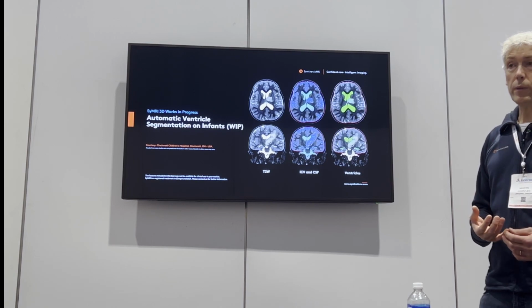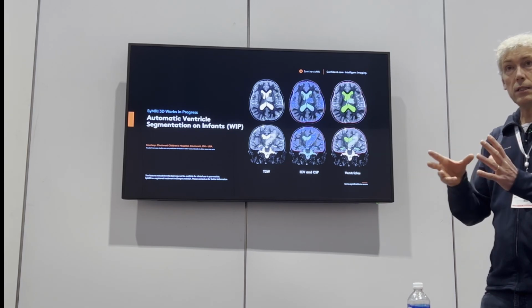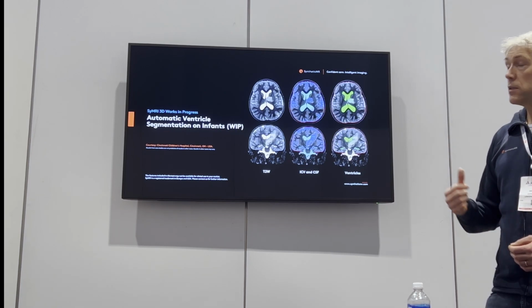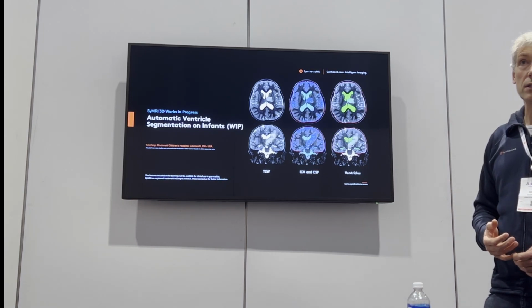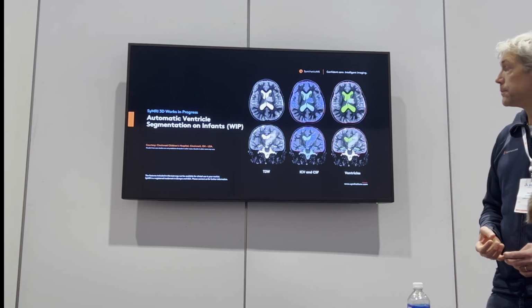There are quite a lot of companies around that do parcellation. They have a standard model that is then morphed to your particular patient, but it has its limits on how much you can morph. This is purely tissue-based. For every voxel, there's really a minimum of geometrical restrictions. So any shape would do. Highly irregular shapes would be fine.